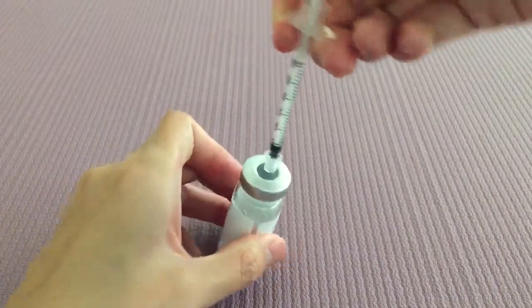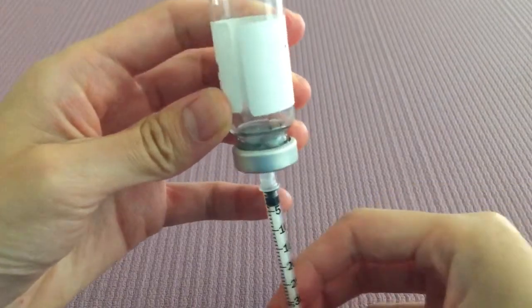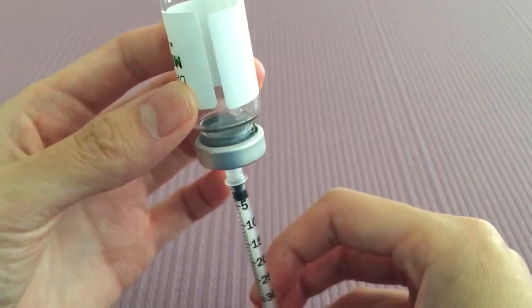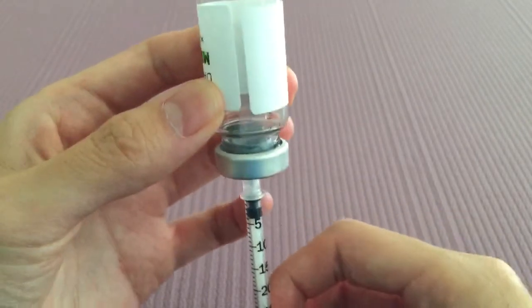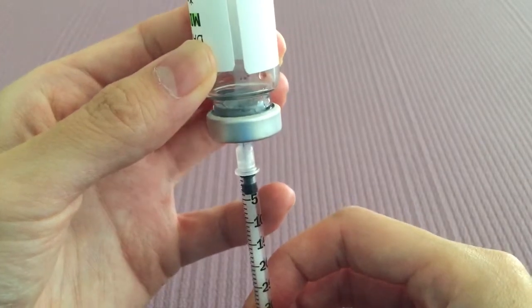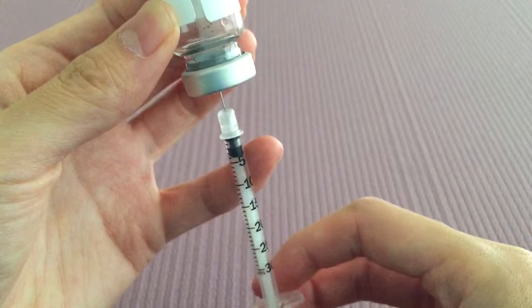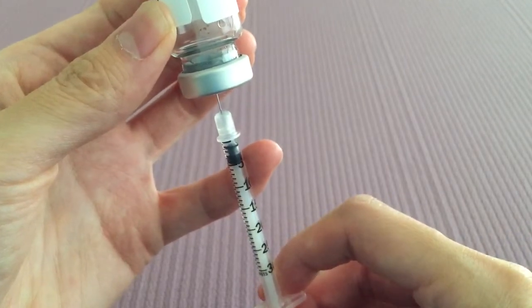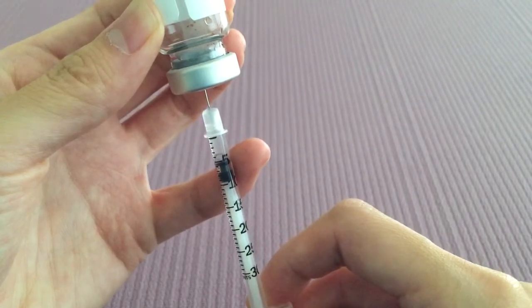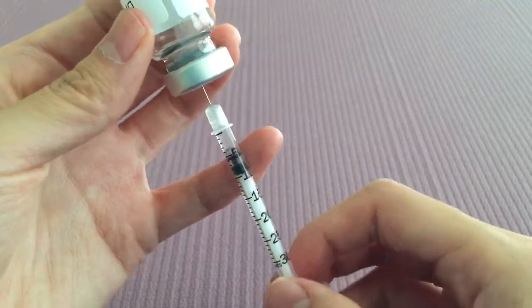Then you're going to take your vial and flip it upside down. Since I don't have that much liquid left, you always want to make sure that the tip of your needle is below the actual water line. So I'm going to have to pull this pretty far down to make sure it's under. And then I'm going to draw up my five units of Micro HCG. Don't worry about air bubbles — you can always just tap them out right before you're about to give the injection.